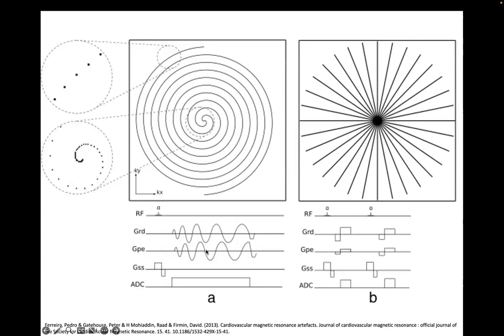So here's a very interesting pulse sequence where we have an RF pulse and it has a slice selection. Okay, so now we have selected a slice of the patient here. And what I'm going to do is, while I am acquiring my data, I will oscillate both the, let's call this the x gradient and this the y gradient. So I'm going to oscillate the x gradient back and forth, right? And change its amplitude. Its amplitude's going to grow. And I'm going to oscillate the y gradient back and forth, right?